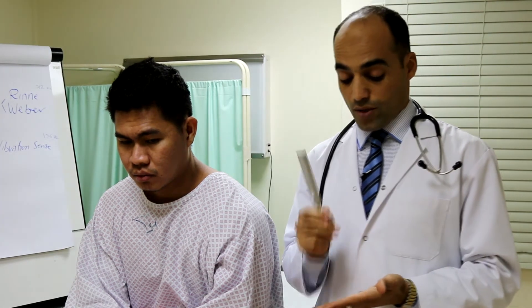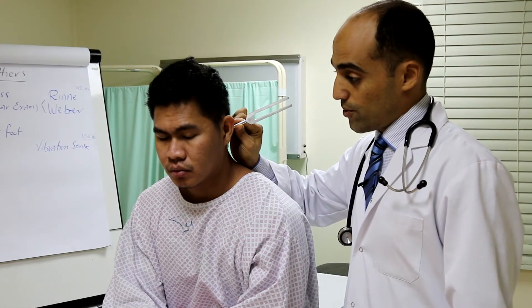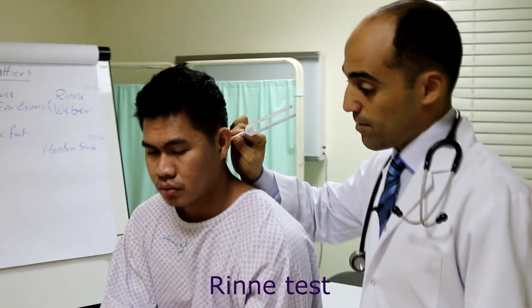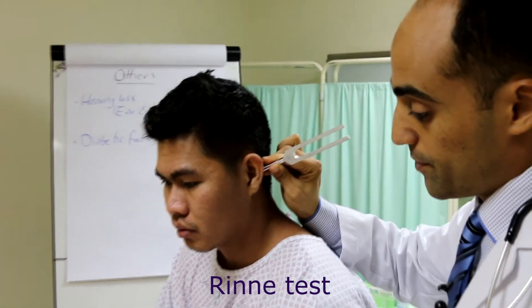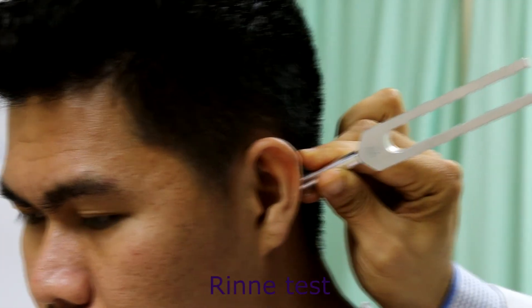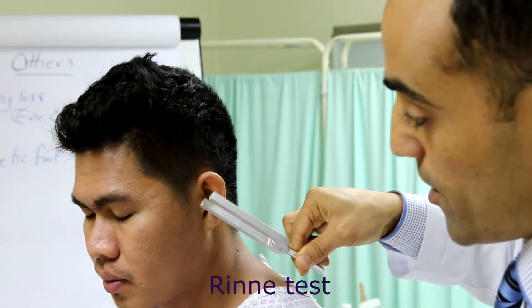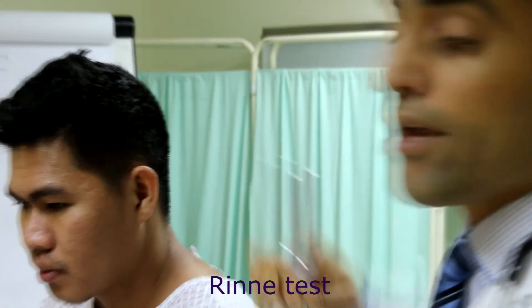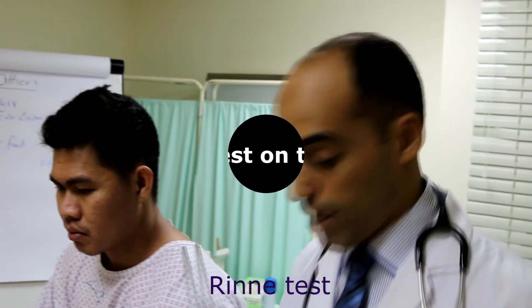This is the Rinne test. Mr. Sami, I'm going to do some tests to test your hearing. Do you hear this tone? Please let me know when it stops. Do you still hear it? Yes. This is a normal result — air conduction is better than bone conduction.